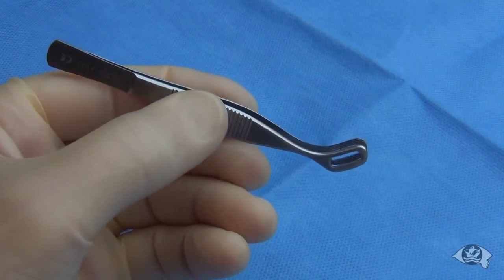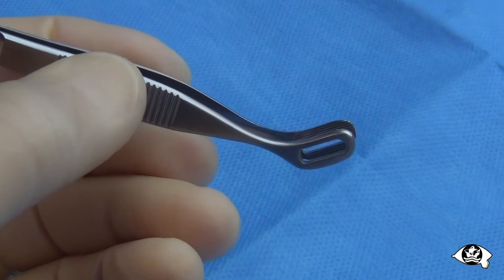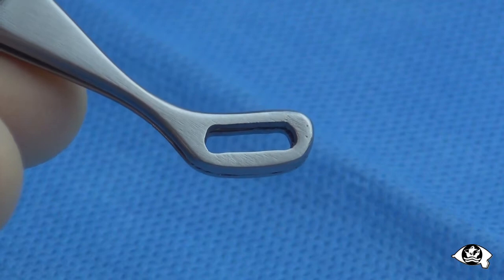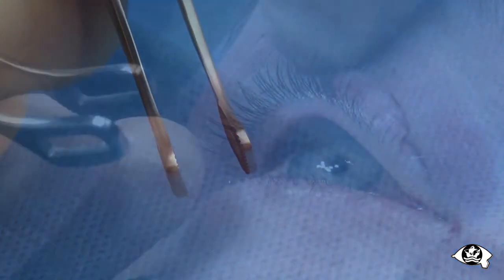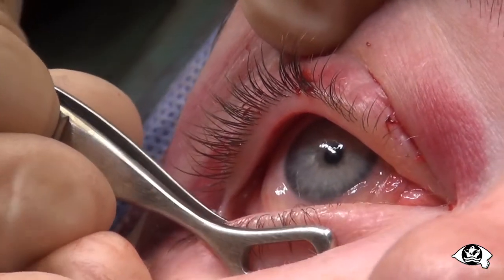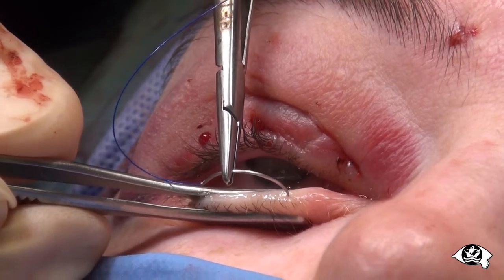The new tarsal forceps shown here have been specially designed to grasp the eyelids securely and atraumatically while everting the lid margin. They hold the lid flat and provide an unimpeded view of its margin. The lid is grasped so that its margin is just proud of the forceps. As it is everted, a good view of the margin is obtained.